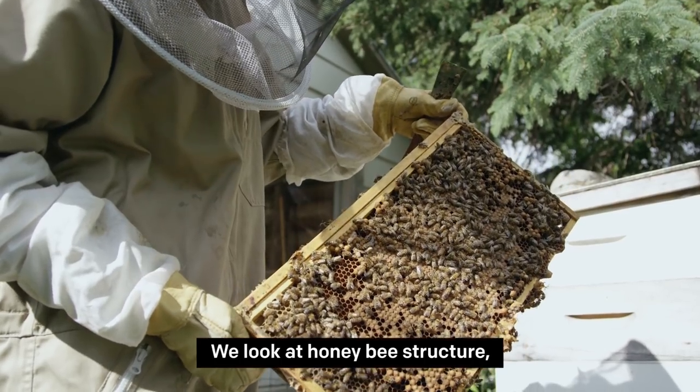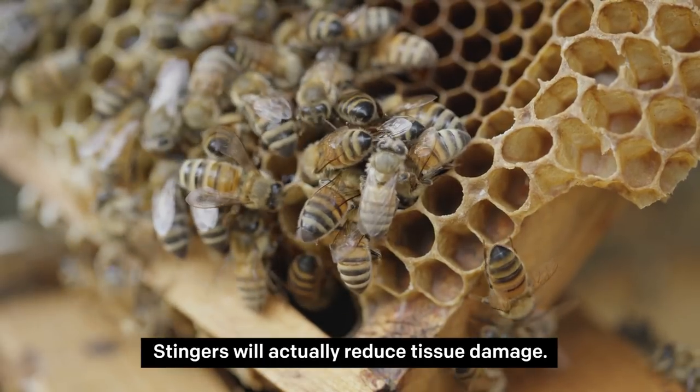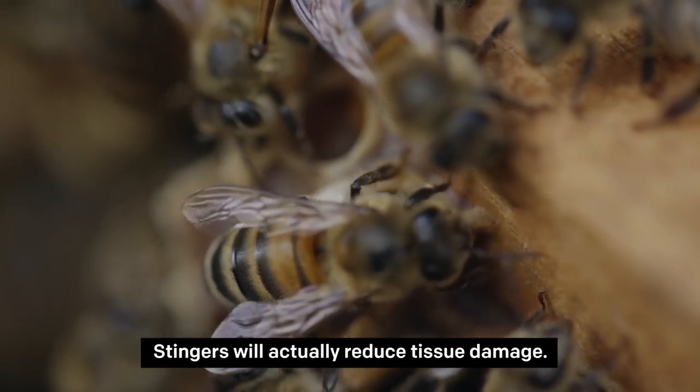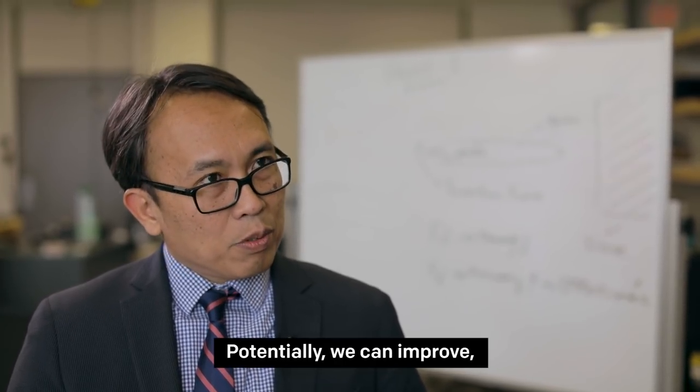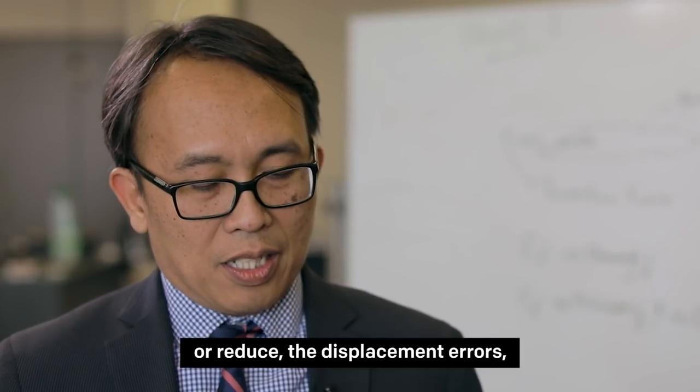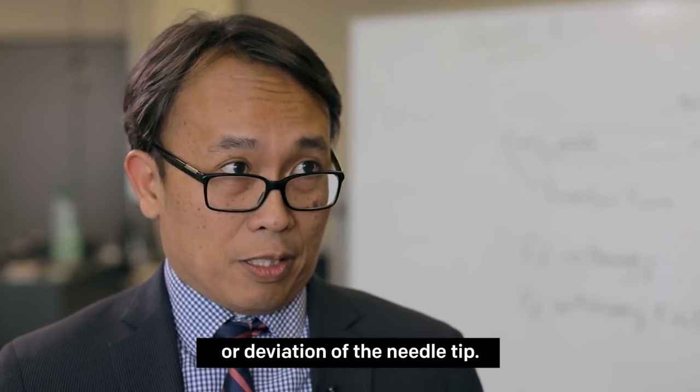We looked at honeybee stingers and other insects. Stingers actually reduce tissue damage. By implementing that kind of structure, potentially we can reduce the displacement errors or deviation of the needle tip.